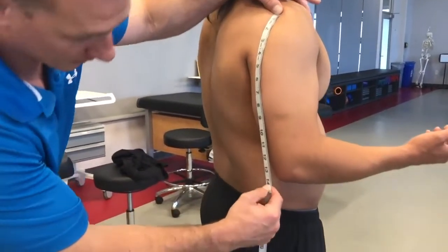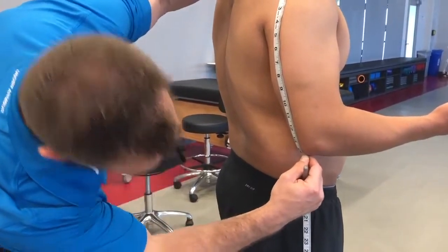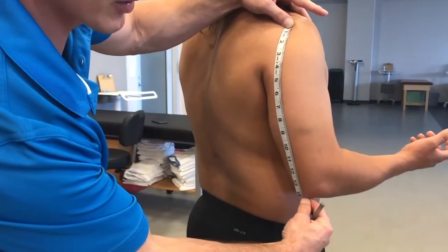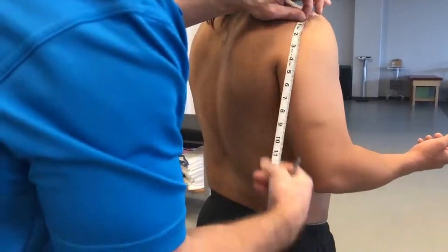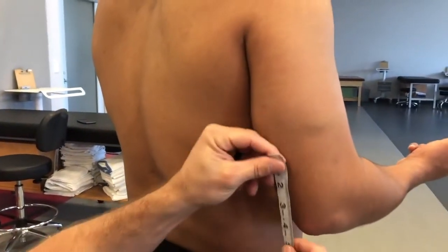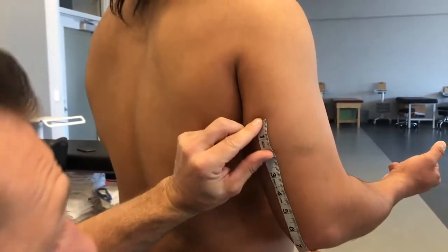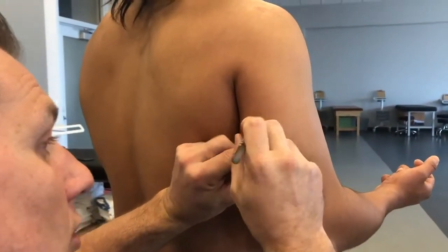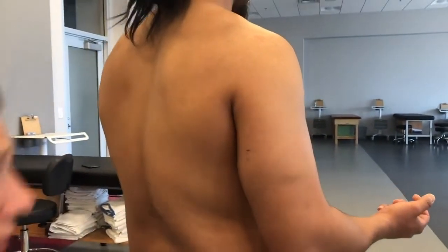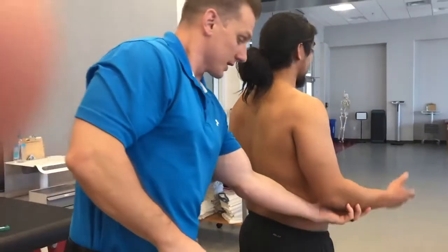You're going to take a measurement straight down the posterior aspect of the humerus down to the olecranon process. We have a measurement of 14.5 — half of 14.5 is going to be 7.25. So we're going to take our measurement from the olecranon process up the humerus and mark 7.25, making sure that we're on the posterior aspect.